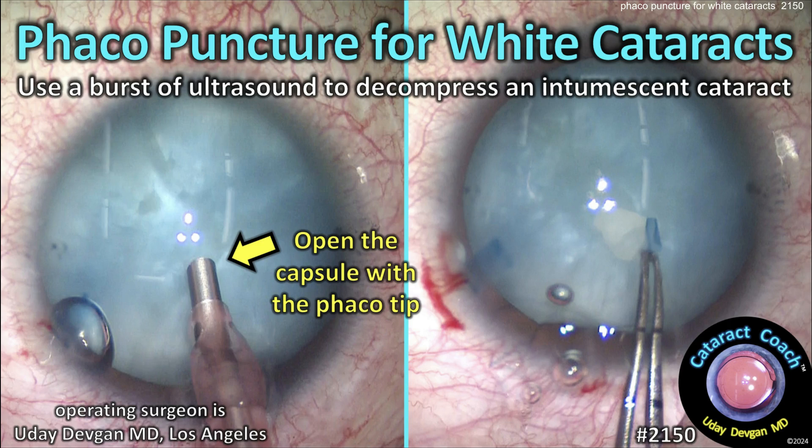CataractCoach.com — phacopuncture for white cataracts, using a burst of ultrasound to decompress an intumescent white cataract.